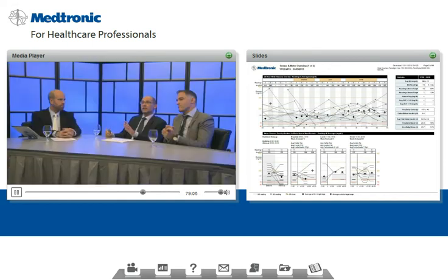So my point of view is, having the data in front of you, now you can have a discussion. Now you have the issues at hand, then you can confront them, ask the patient specific questions, and deal with the specific issues. And this is the power of downloads and a web data management system. Okay, I think we had a point here.